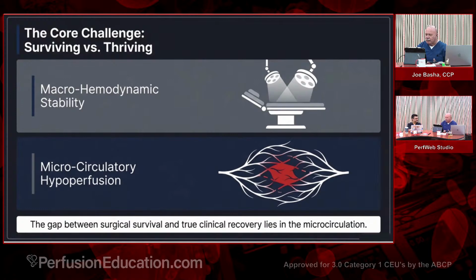I was concerned from the very get-go that the pressure didn't look right. Something wasn't right. What do you mean it didn't look right? The pressure waveform didn't look right. Okay, the arterial waveform, I see what you're saying. I was like, I don't really trust this. Were you not trusting the art line? I was not trusting the arterial line pressure that I was seeing. Okay.